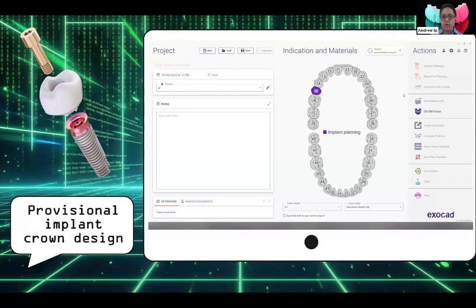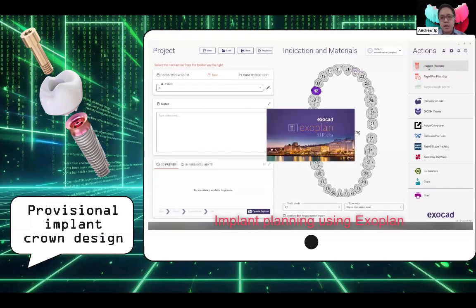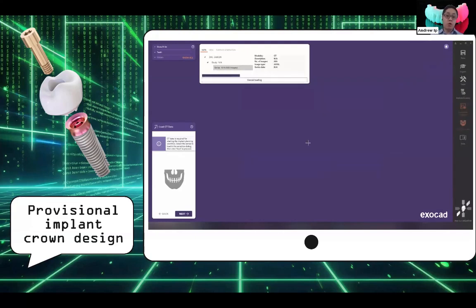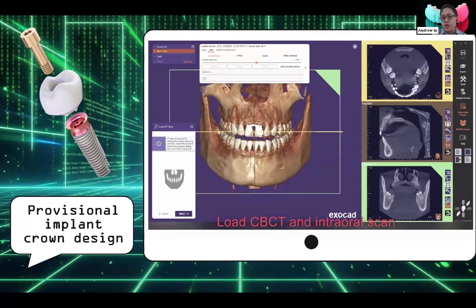Of course, you could go for something like this, where this was an interesting patient, and I'll go through this case in a bit more detail next. But here I had a very anxious patient. So we had to do everything or as much as possible before implant placement, certainly before tooth extraction.